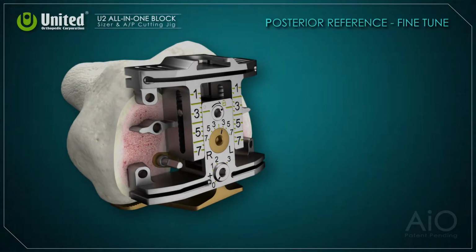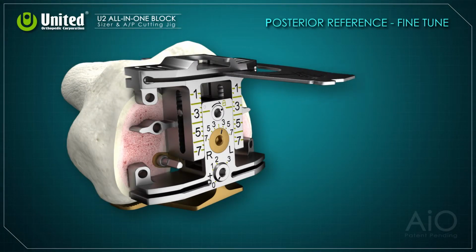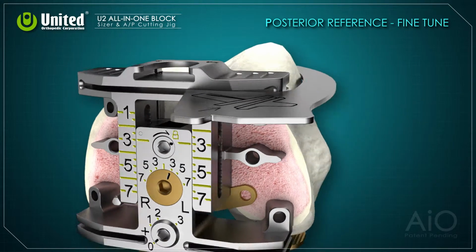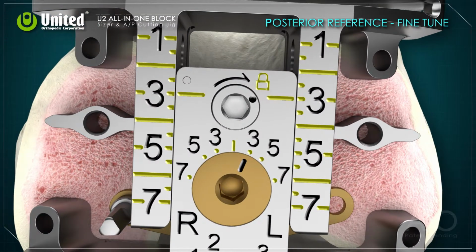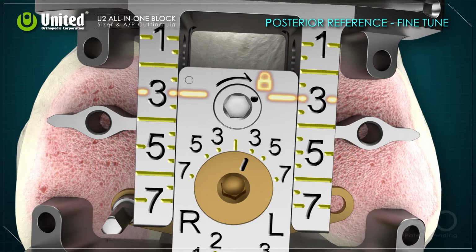In the posterior referencing system, if anterior notching is a concern, the fine-tune function can elevate the block by distributing the cutting volume between both the anterior and posterior sides. In this case, the posterior cut might be more than 9 mm. During fine-tuning, make sure that the AP cutting distance is locked.